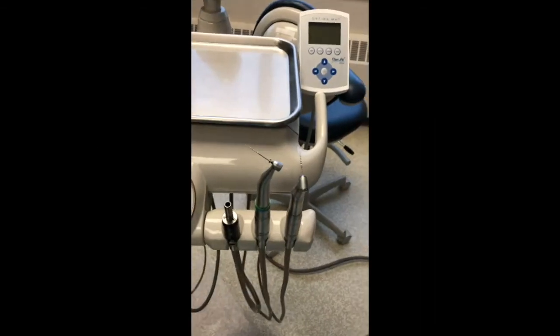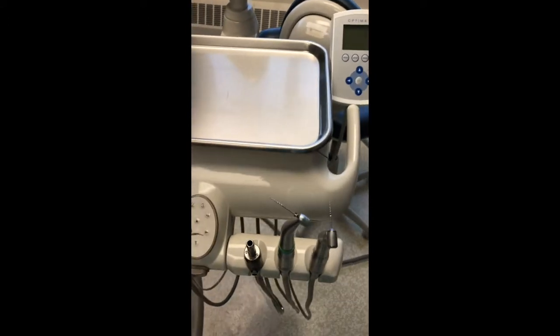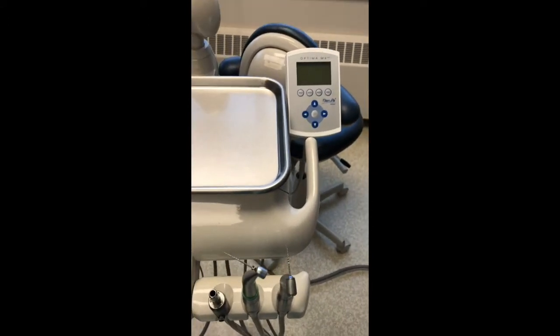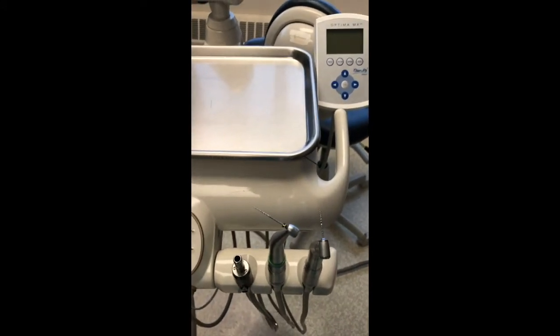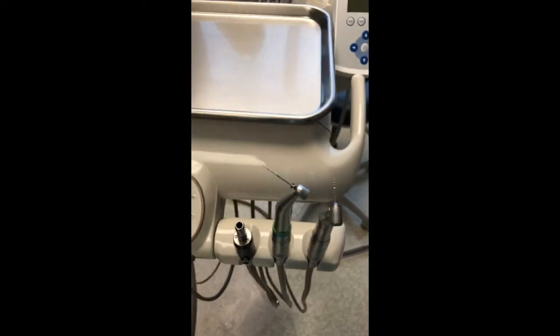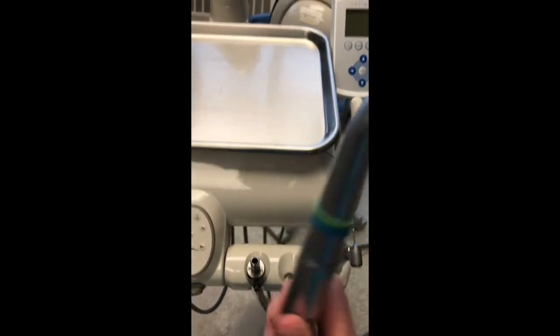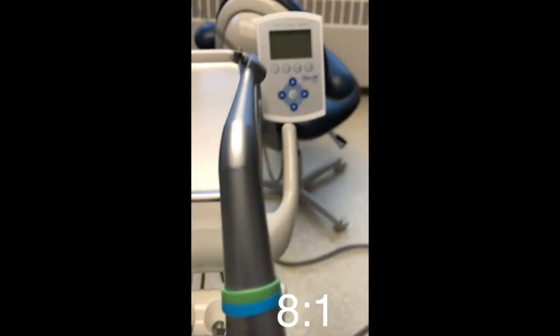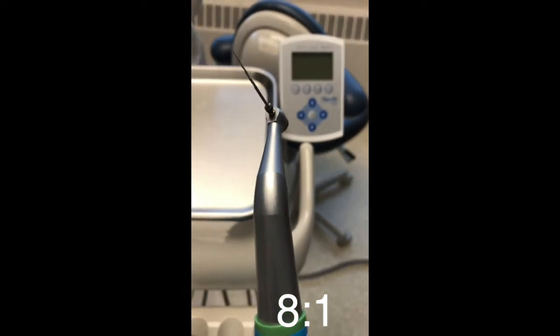What I'm going to show you now is how to utilize your electric handpieces for non-surgical root canal therapy — if you don't have a Promark motor or if you don't want to take your Promark motor into the operatory, as we're trying to reduce the number of items in the operatory during these times. You'll see here I have two handpieces set up: this one is an 8-to-1 gear reduction handpiece.